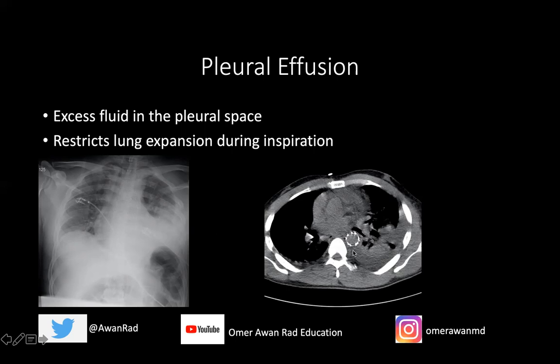On the CT, you have this meniscus-shaped or comma-shaped fluid layering dependently. This is a nice example of what a left pleural effusion looks like on CT. Notice it's darker — hypodense — compared to the surrounding visualized musculature. This is a nice example of what a left pleural effusion would look like.